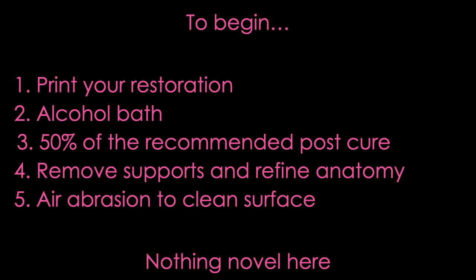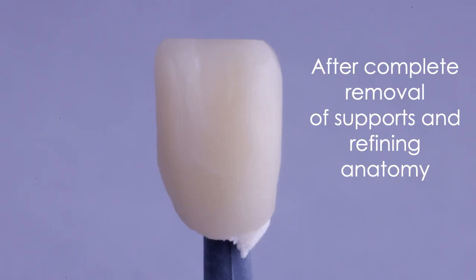Once all the supports are done and you have your restoration exactly where you want it — so once again, if it's Flexera you may want to refine the anatomy a little bit, if it's a night guard you won't necessarily do that — you want to make sure you get all those little support nubs off by this point.